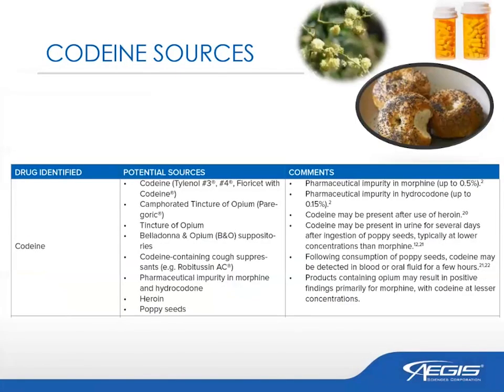Patient underreporting and denial of non-prescribed or illicit drug use are common. However, there are instances when an unexpected positive result has a rational explanation that does not involve extracurricular drug use. It is important to explore all potential sources before enforcing disciplinary action.